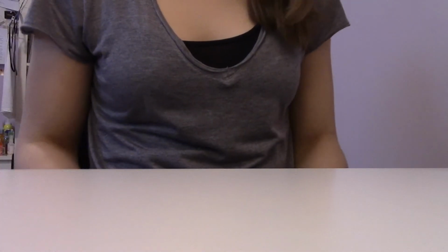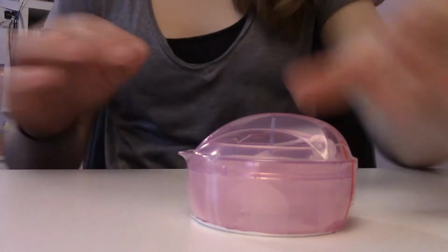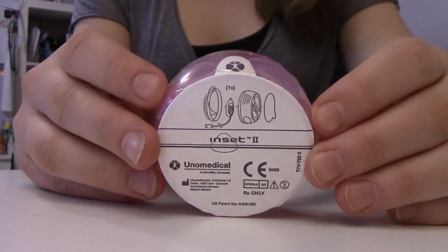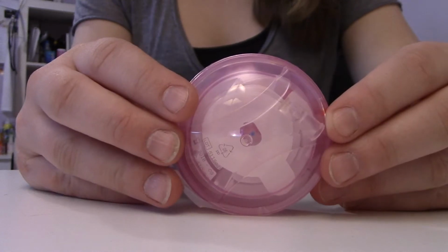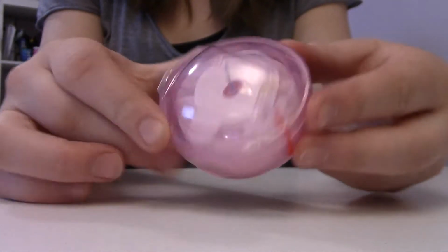Okay, so just a list of some things you're gonna need for this video. You're gonna need your insertion site. So mine's just this basic automatic dispenser, so it pushes the needle in for you. I do believe you can also get manual ones with Animas, and this is the automatic, so it automatically pushes the needle and stuff in for you.